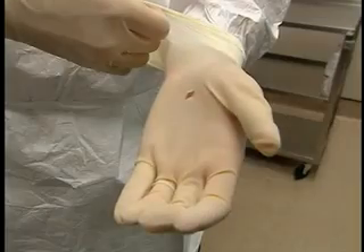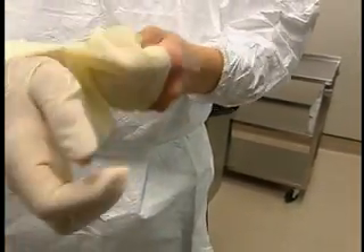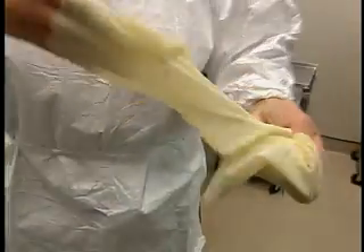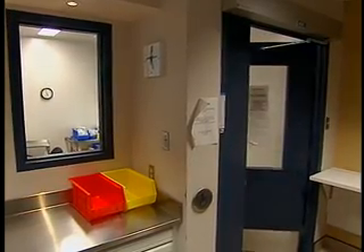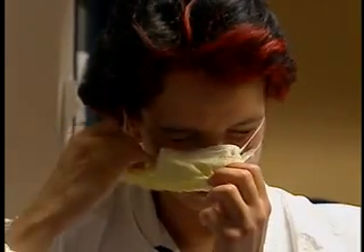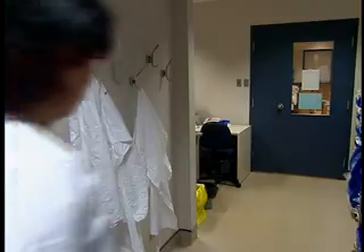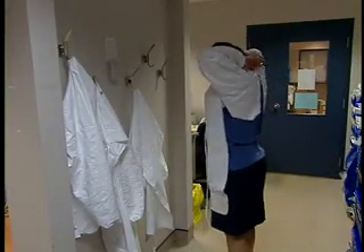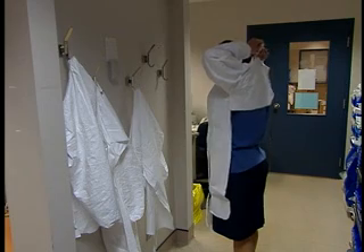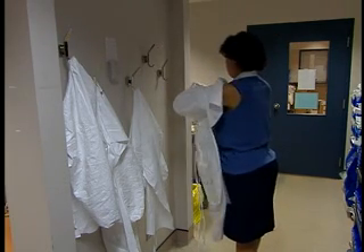If your gloves are torn, punctured or very contaminated, remove them and perform an antiseptic wash before putting on another pair. If you have to leave the aseptic preparation area and the anteroom, remove and discard your gloves, mask, beard cover and shoe covers. Your gown should also be removed, but it can be reused on the same day during subsequent work periods. Follow aseptic procedures to the letter and throw out any products that may be contaminated.